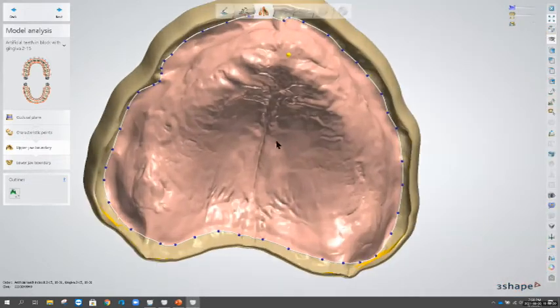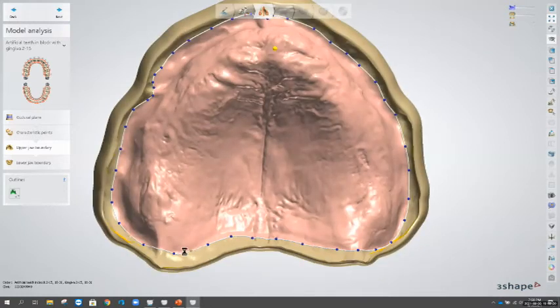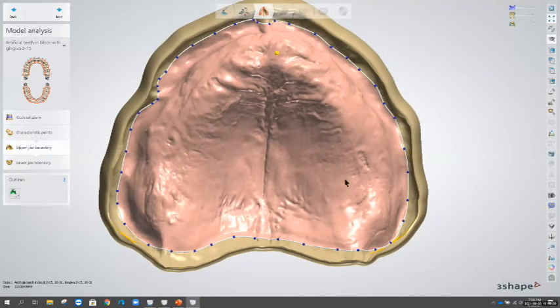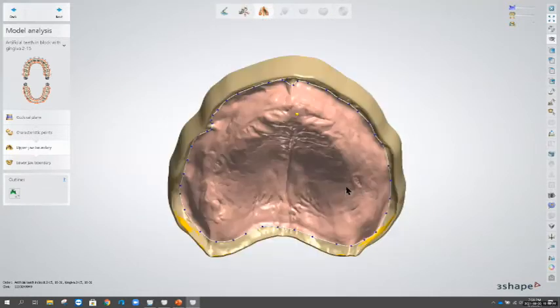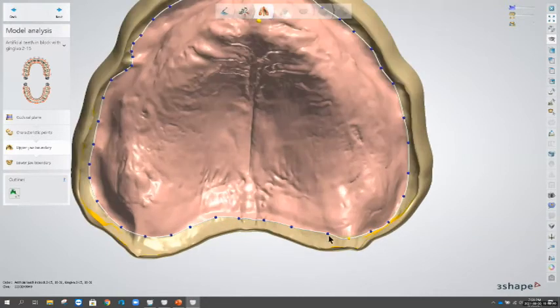Thank you. And we've got another one. With digital dentures, an edentulous patient that has never had dentures, we would have to do occlusal rim to get VDO and midline and canine and smile line first, right? Or you cannot do the digital dentures in this case, correct?